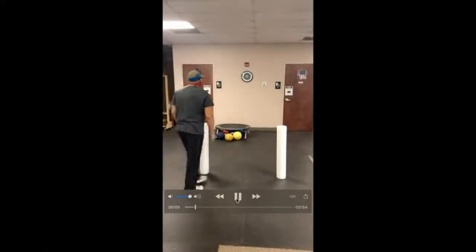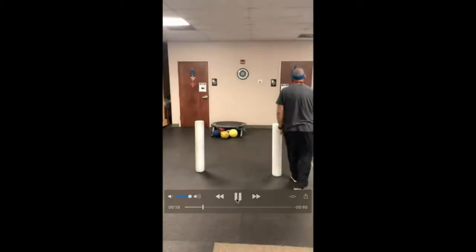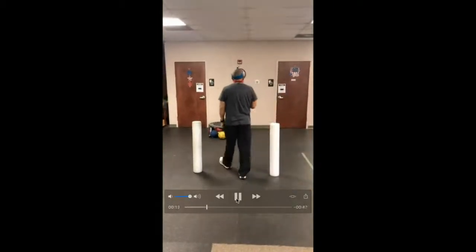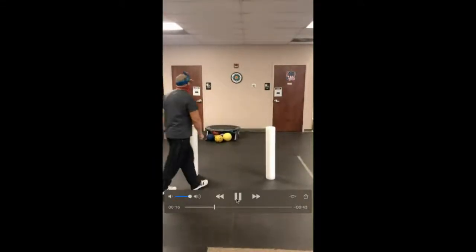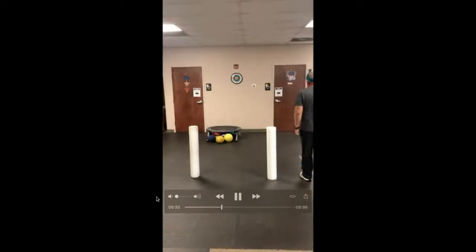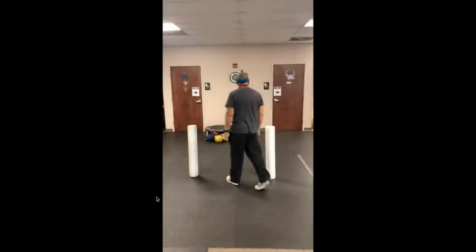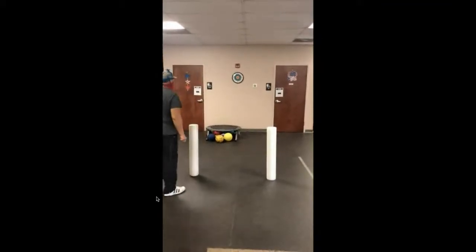So he's got the laser at a target that's on the wall. I just used one of the motion guidance contact pads and stuck that onto a clock that we have in the clinic. And I have 2 foam rollers. So there's several things that are breaking down here. So we have the person doing the infinity walk, which means his head neck is moving, but his visual gaze is fixated on a single target. Okay.